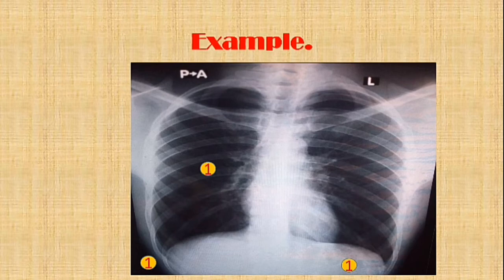There is another air density here, which is not as dark as the rest, or not as radiolucent as the rest. This is because of the superimposed soft tissues that add a little bit of radio opacity to it. This is the air bubble of the stomach. The second density that we can see here is the fat density, just adjacent to the air surrounding the individual. This is subcutaneous fat. It is dark but not as dark as the air density.